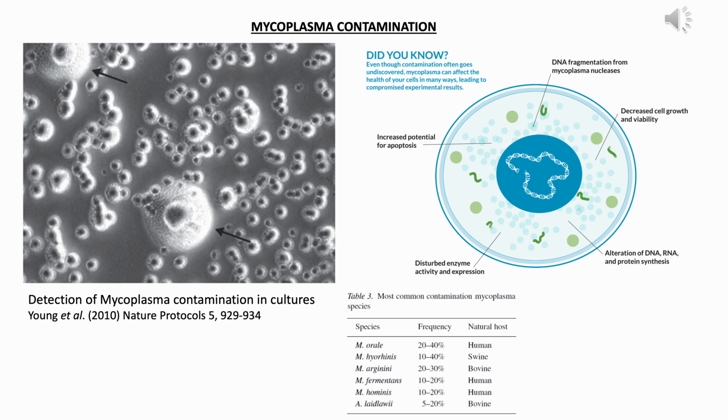Now, what are these mycoplasmas? Some biological features. They lack rigid cell walls. They can have a generation time of 1 to 9 hours. They are very slow growing. Okay. But then they are very fast as far as spreading is concerned. So they have a very long lag phase, that is true. So when you want to detect them, you need to keep the agar plate on which you can detect whether mycoplasma contamination is happening or not for more than 1 week.